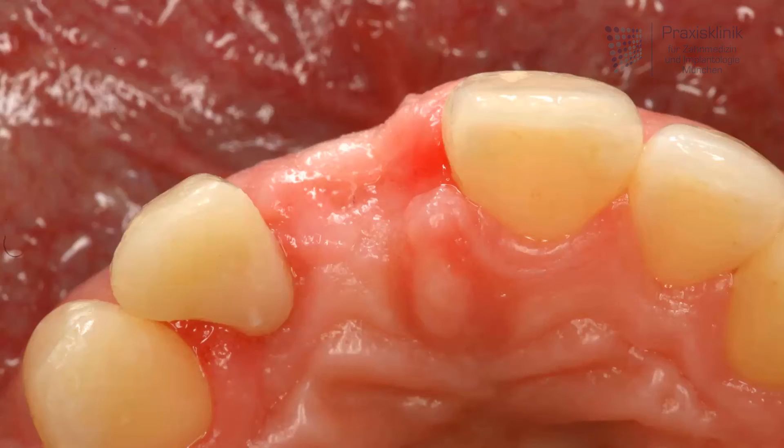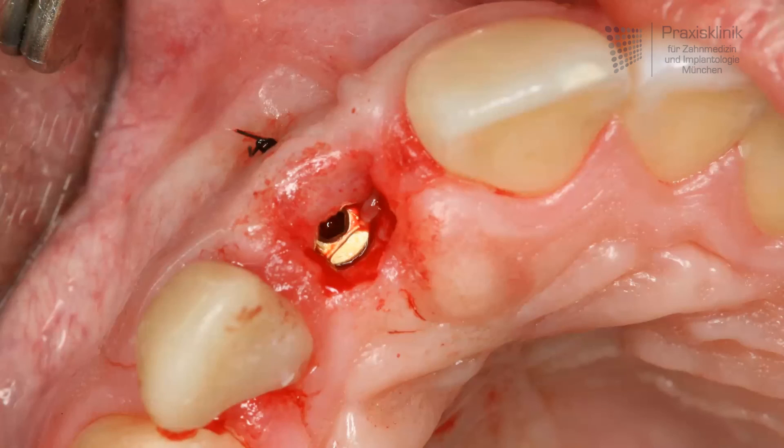After the healing period, the implant is uncovered. That means we have a small cut through the connective tissue above the implant, and the tissue is used to augment the buccal part of the gum to have a very thick soft mucosa area there.